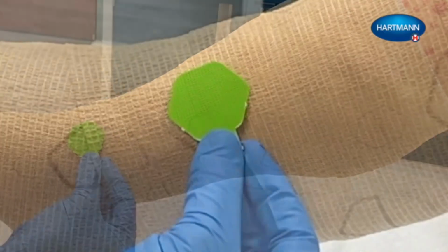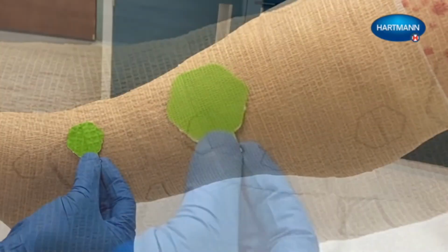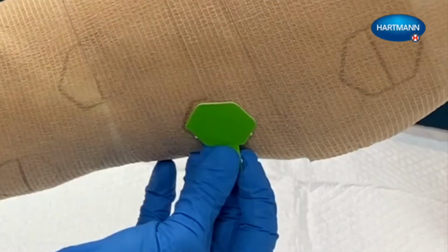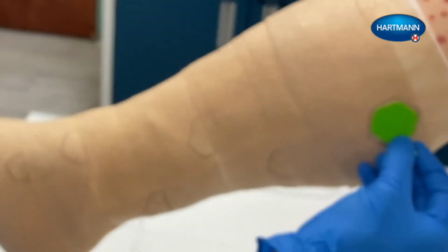Press out the perforated hexagon template and use it to check the correct elongation of the second layer. If the indicator is correctly stretched, you will see the printed indicator at the edge of the template.